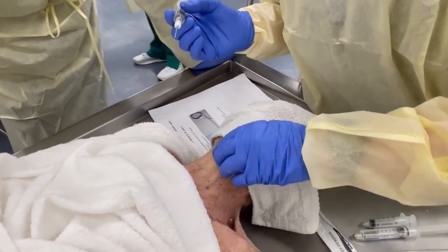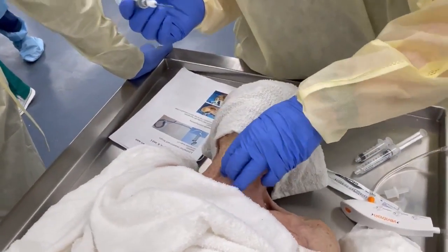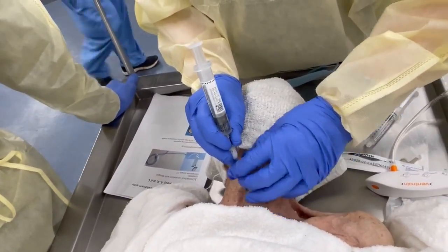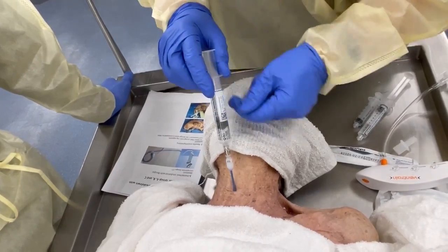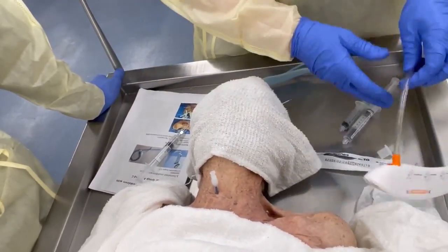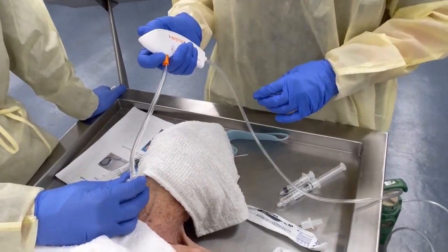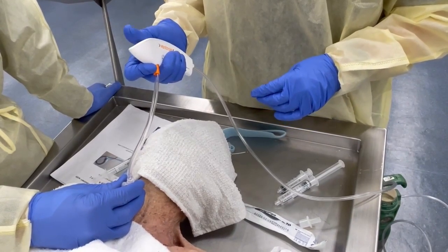I'm going to find the cricothyroid membrane. Here's my larynx — I have to assume it's right about here. I'm going to go in, aspirate — got air. I'll pull my needle out. Now watch: we'll hook this up. Stabilize that. Two seconds in — I'm sucking the air out. Two seconds gives 500 ml at 15 liters per minute.